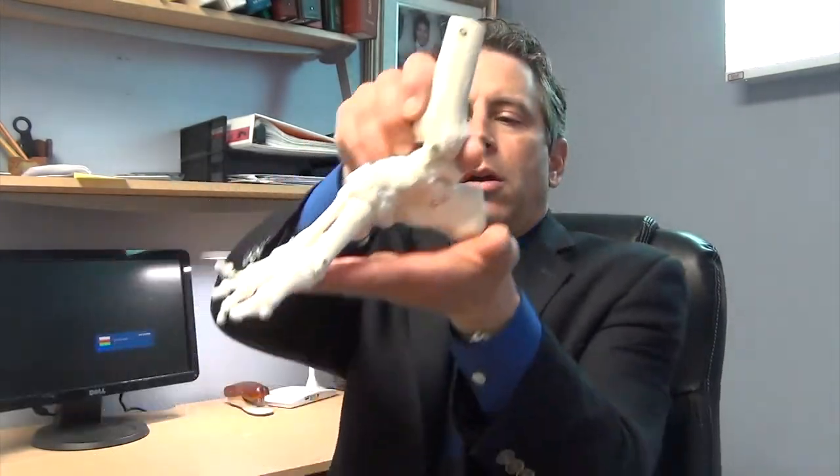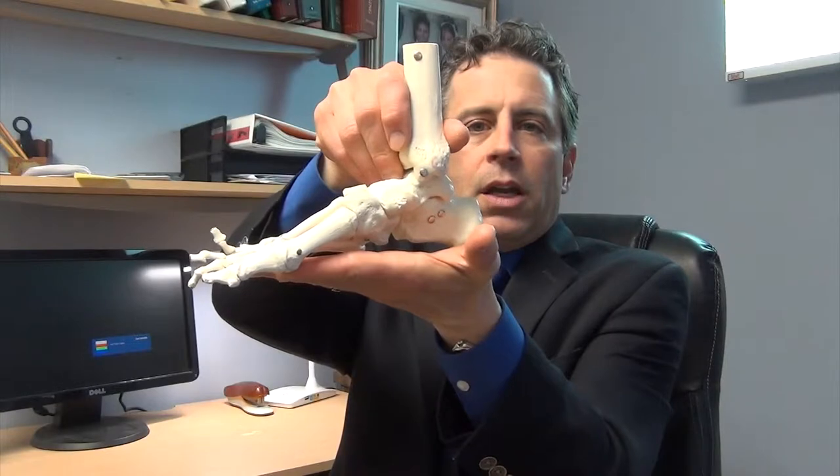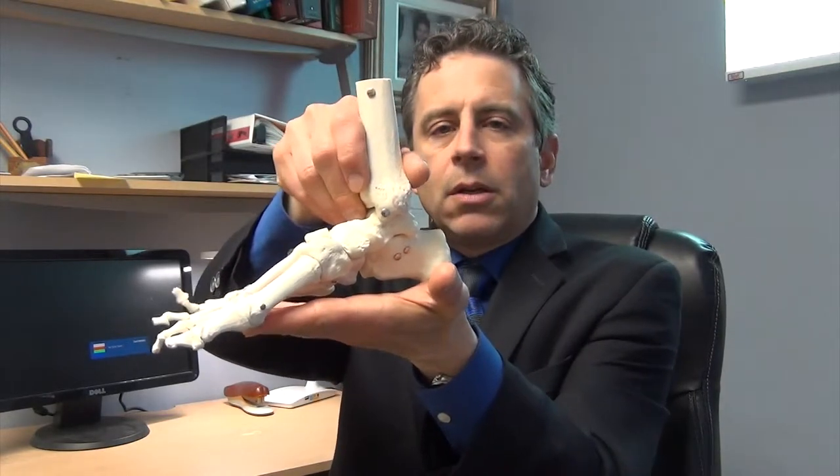Well, there's a problem with that. When you stand into one of these foam blocks, your weight is going to push your arch down, and the most you can support is the arch already collapsed. By that time a lot of the problems have already happened and you're not really solving much. So I do not mold with my patient standing on the floor. I actually do a press molding, and I'm going to show you how I do that right now.